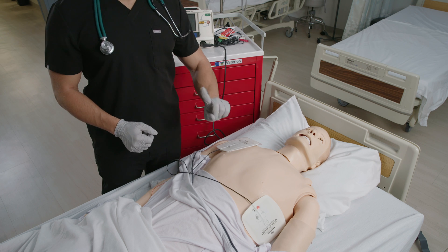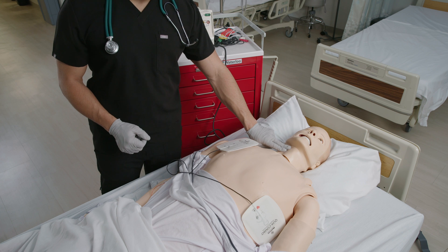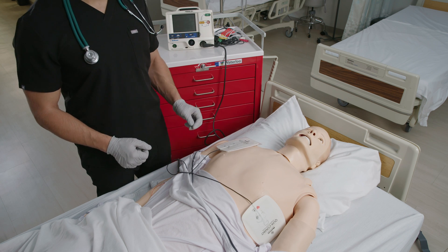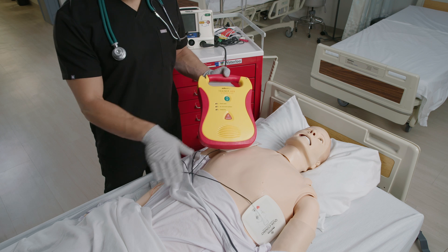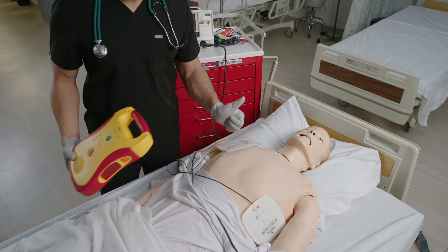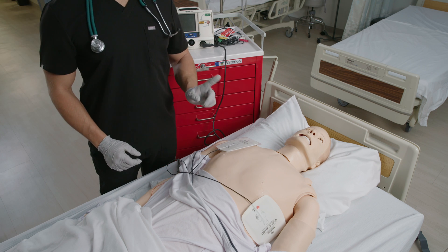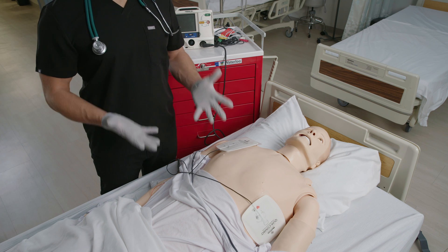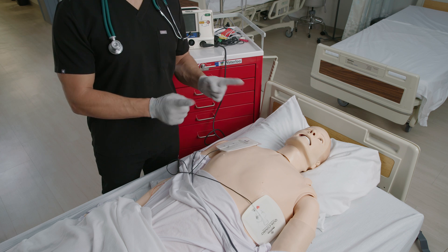D for defibrillation is when clients don't have a pulse, so no synchronization is needed. It's a way to convert a rhythm back to normal. An AED will deliver a high energy shock which temporarily stops the heart to return it back to a normal rhythm. Rhythms that can be defibrillated are ventricular fibrillation (V-fib) or pulseless V-tach. So don't forget: if they have the V, give them the D.